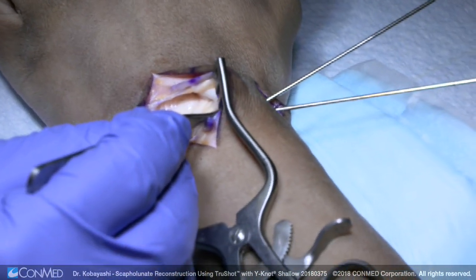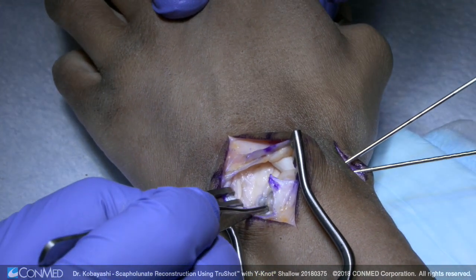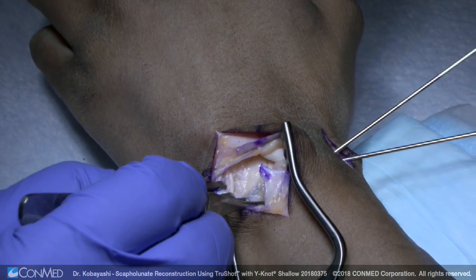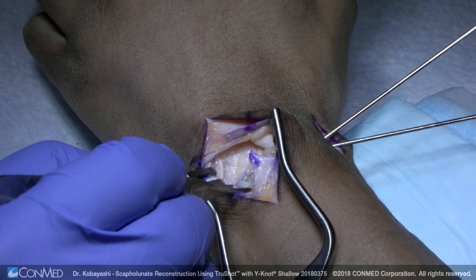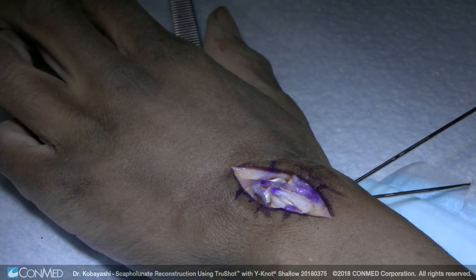So this is the dorsal intercarpal ligament reconstruction for a scapholunate ligament tear. You can see that the anchor is into the lunate. We have locking whip stitches into the dorsal intercarpal ligament, further augmented with sutures into the dorsal radiocarpal ligament here, and you can further augment this with other sutures of your choice. Then close the capsule and extensor retinaculum — just sew this back together and complete it.